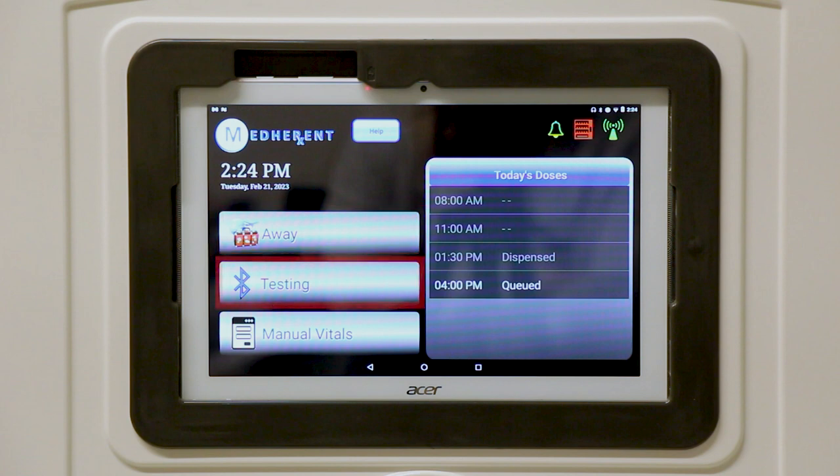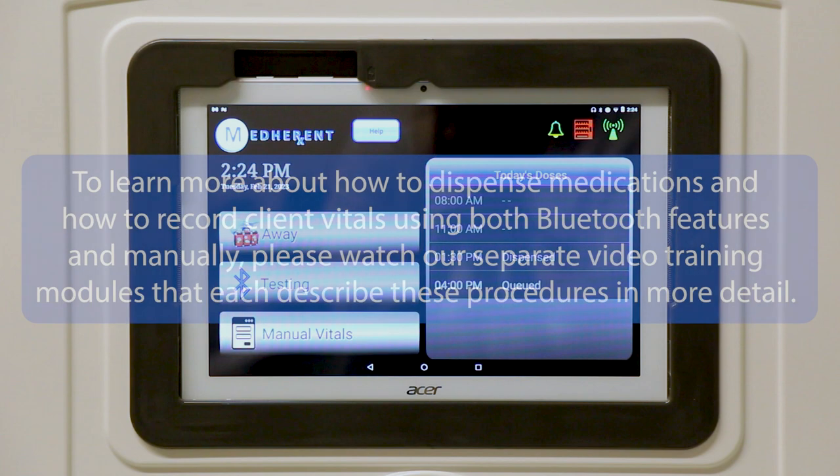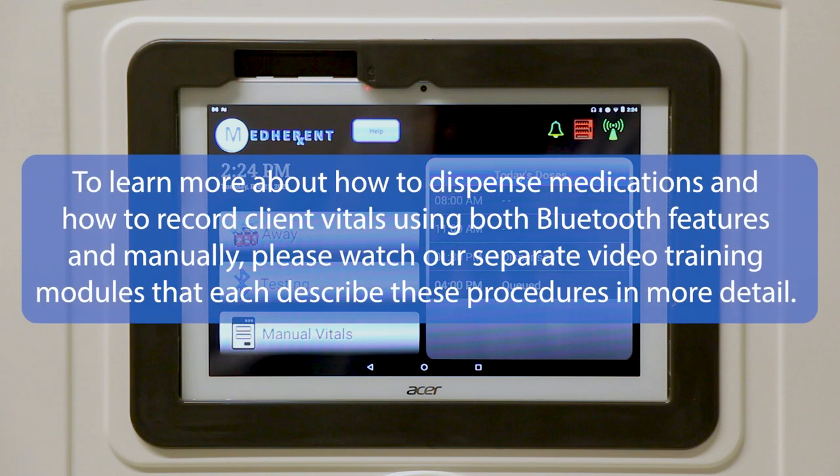This is the Bluetooth feature for taking patient vitals using Bluetooth functionality. This button, labeled Manual Vitals, allows caregivers to take patient vitals manually. To learn more about how to dispense medications and how to record client vitals using both Bluetooth features and manually, please watch our separate video training modules that each describe these procedures in more detail.